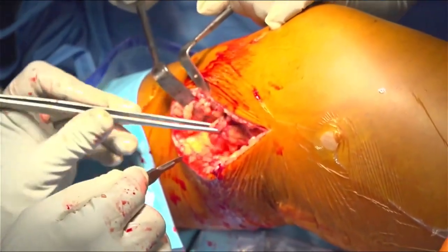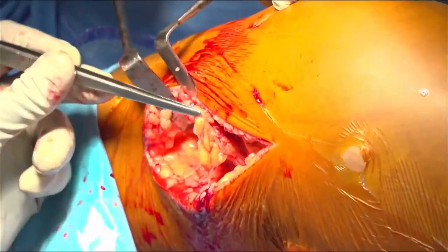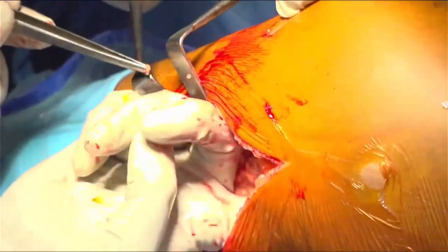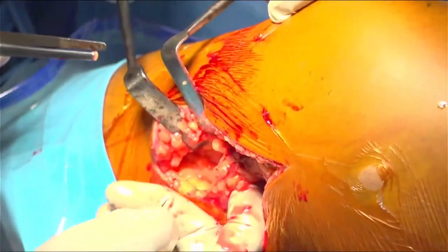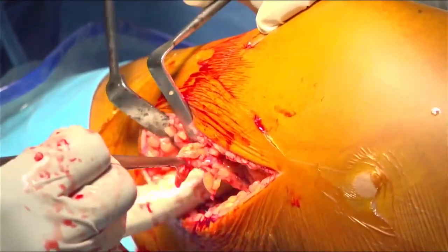So this is the area of the MCL that we are talking about. So probably this is the meniscus.